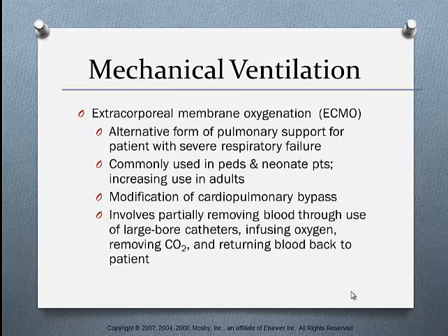ECMO. ECMO is an alternative form of pulmonary support. It's commonly used in pediatrics and neonates, although it is being used in adults also. It's kind of a modified cardiopulmonary bypass. What happens is we partially remove blood through the use of large bore catheters, infuse it with oxygen, remove the CO2, and then return the blood back oxygenated.